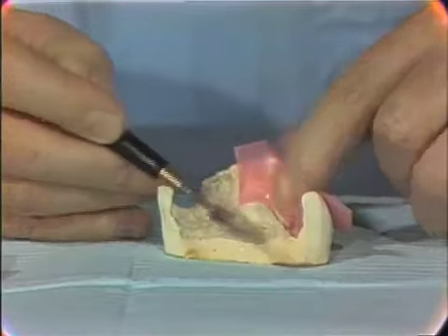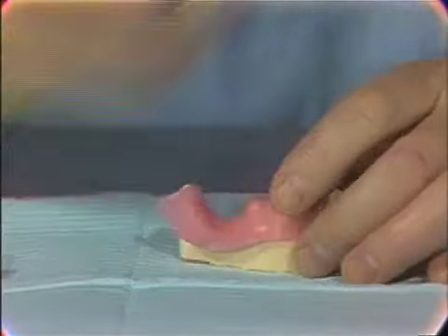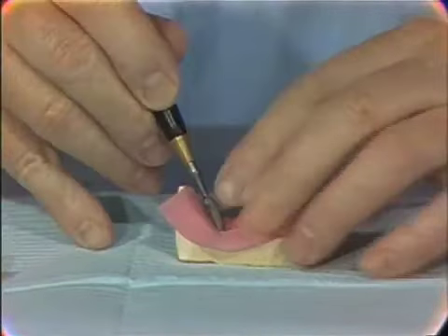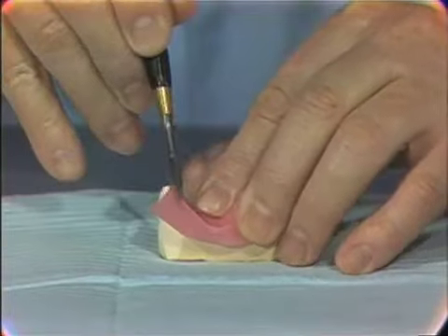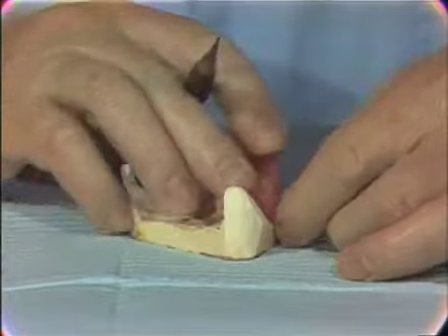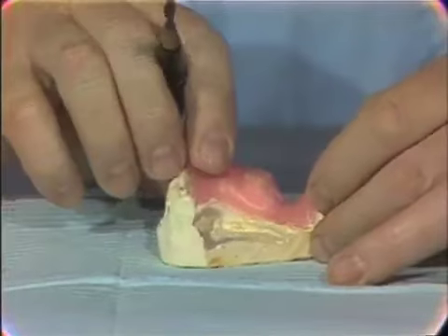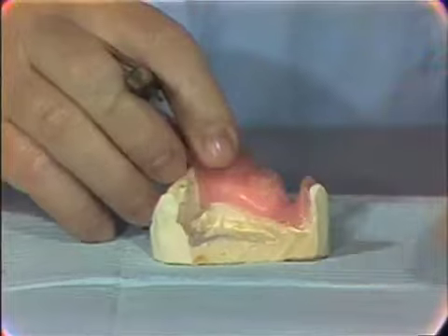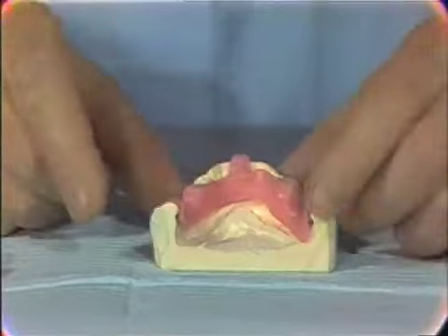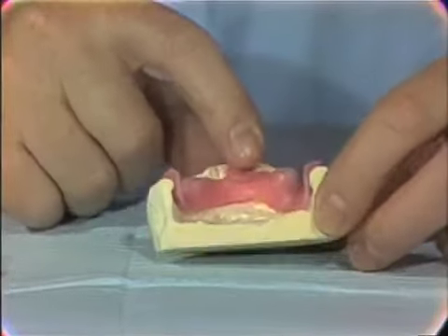But as I'm doing in this case, I'm going to go ahead and adapt this right to the model without a relief and make sure that it fits the model accurately. So by just adding wax, trimming it away, we would form a wax pattern that we can give to the laboratory technician so that it can be cast in aluminum.